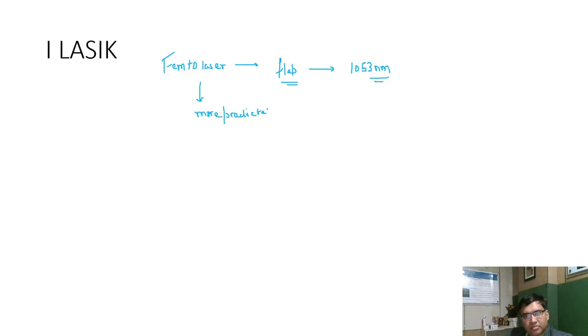It gives a more homogeneous flap. So the chances of buttonholing of the flap or an irregular flap are much less in femtolaser assisted surgery as compared to microkeratome based surgery. That's why a surgery which uses femtolaser is also called bladeless LASIK.